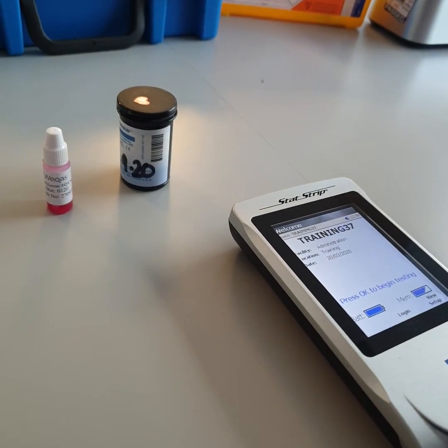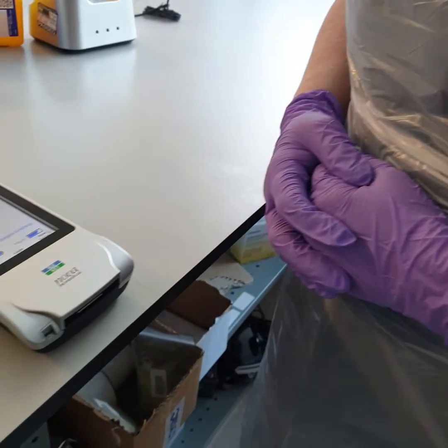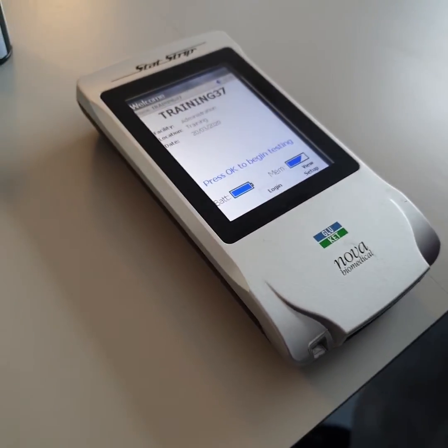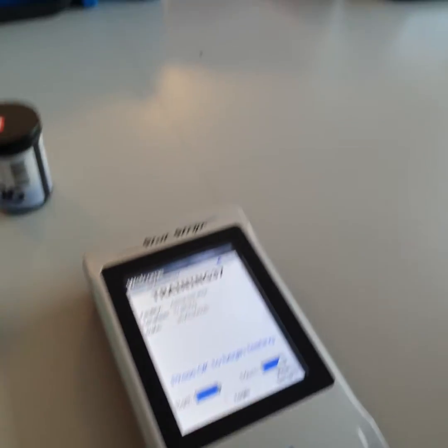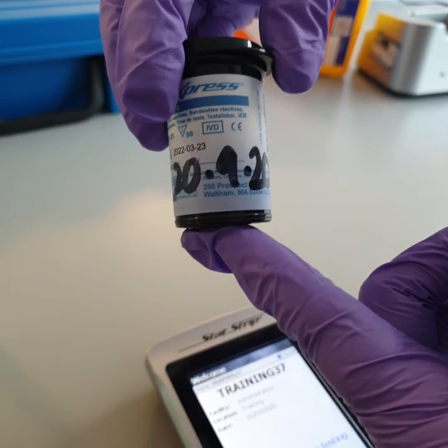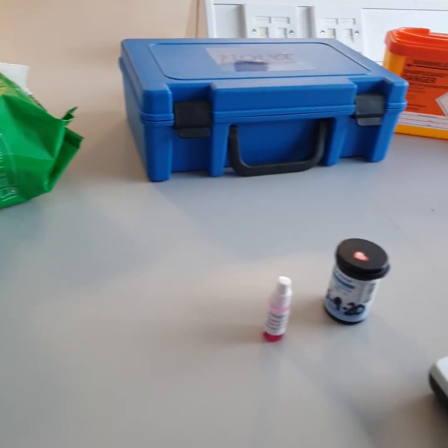To perform this test you need to be wearing the correct PPE. You need to have a QC device — the device locks out when it needs QC. You also need a sharps bin, strips that are in date, disinfecting wipes, an active barcode, and the barcoded EQA sample.